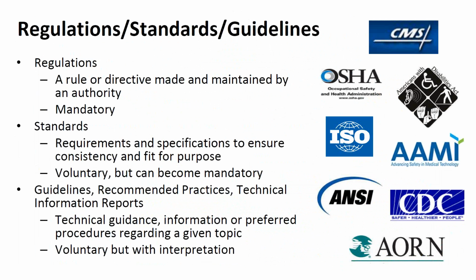So now you are a clinician out there working, and there are regulations, standards, and guidelines. What are they? I want to give a brief introduction of this, and this will lead into where Mary Ann is going to pick up about ST91. Regulations are a rule or directive made and maintained by an authority. In this case, we think of CMS. We all know that we need approval and that certificate so we can get reimbursed, and CMS can come in and audit you.